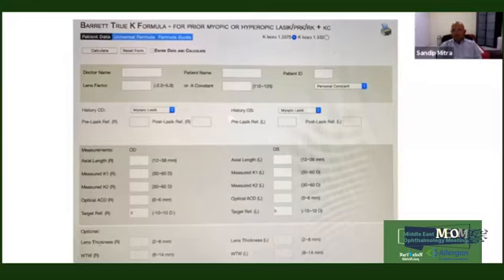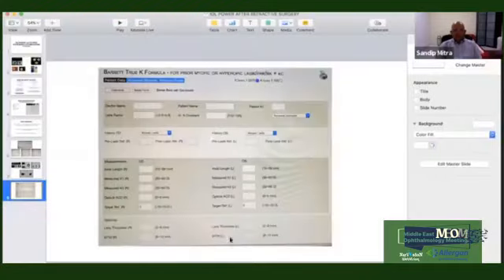So one of the things which I avoid, though people sometimes do it, is choosing premium IOLs in these cases, not putting multifocal IOLs in post-refractive patients. And if you are going to put multifocal lenses, I think you should have enough corneal tissue to do a re-ablation if you have missed the target. So that's it.